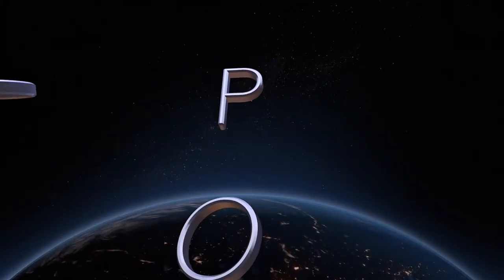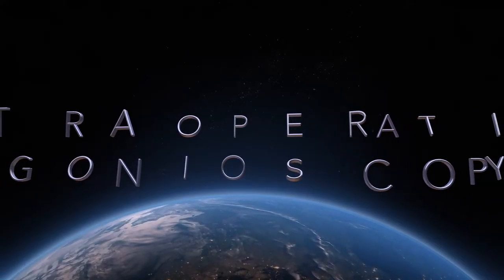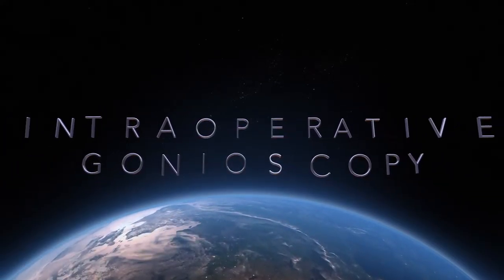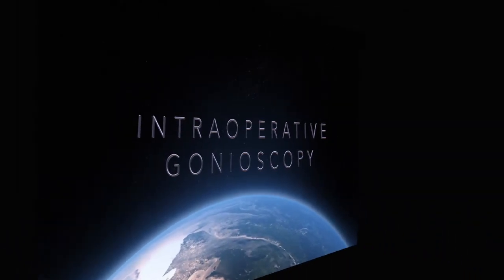Intraoperative gonioscopy is a rate-limiting step in performing any ab-interno angle surgery. In this instructional video, we will cover the essential preoperative steps to ensure a successful outcome.